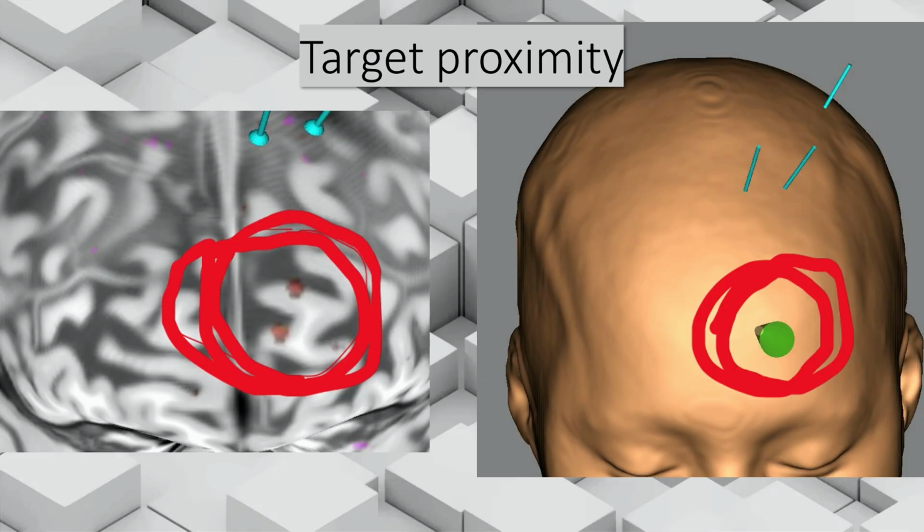And so as a TMS practitioner, especially in the clinic, you'll do all kinds of tricks of ramping up the stimulation level, slapping an ice pack on there. People do lidocaine injections sometimes. You're like, we need the patient to tolerate this, especially in addiction. This is your bread and butter right here, right? So you're like, how can we get people to tolerate it better?